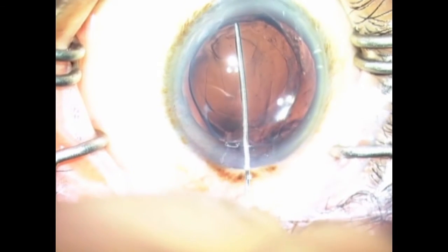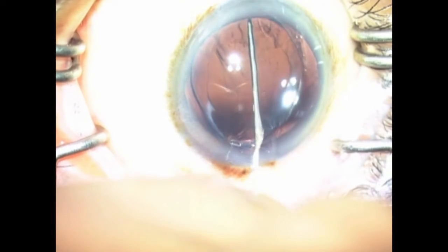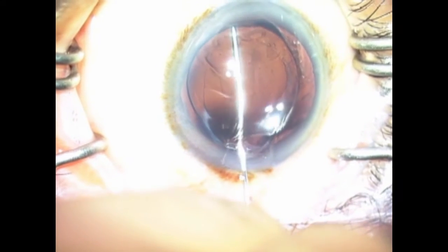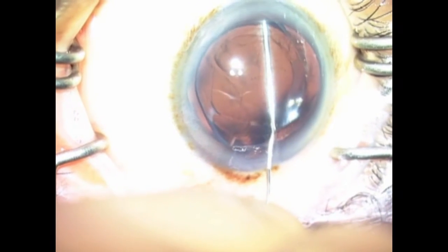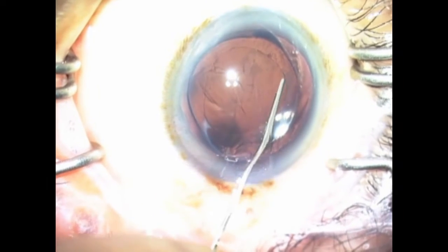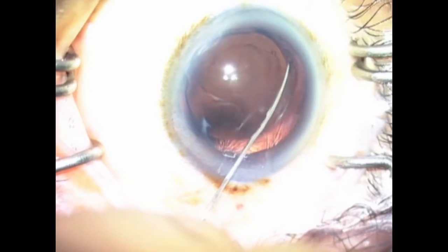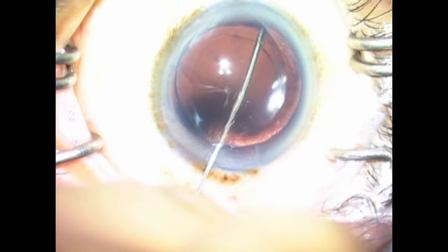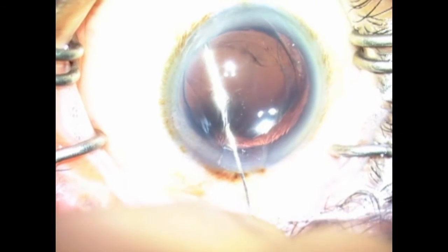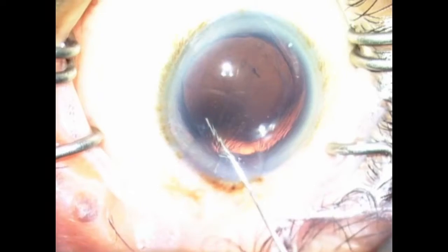The cannula is ergonomically designed to mimic the anterior curvature of the intraocular lens. The tip of the cannula is well beyond the edge of the optic. This would not be possible with a hypodermic needle.